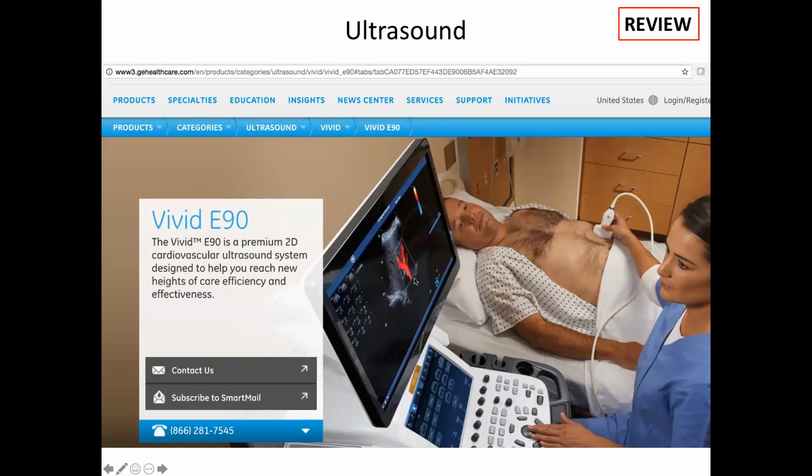And these images come up in real time. They adjust certain parameters to change the image, like focal depth, slice thickness, frame rate, Doppler on, Doppler off, all of these kinds of things. They do all that adjustment in real time with their hand. And then they usually have a bar here where they capture and record short snippets of video, or they'll capture and record single frames and then make measurements right on those frames. And that goes into the report, right?